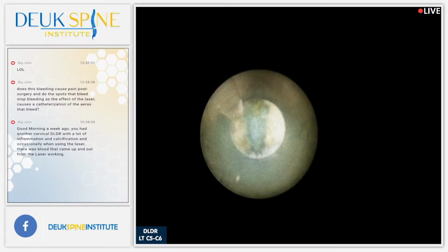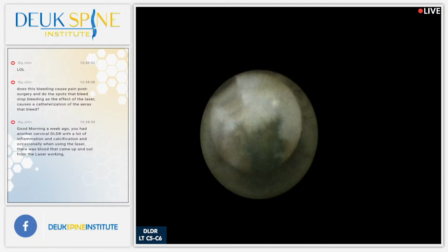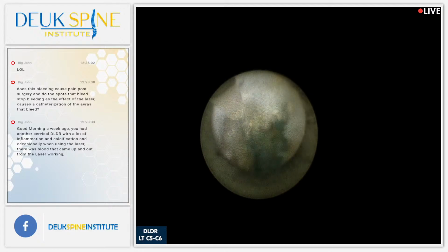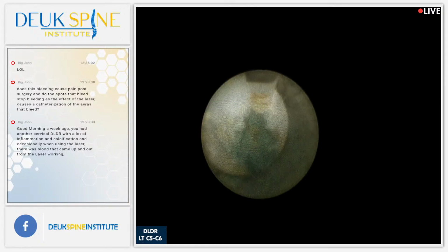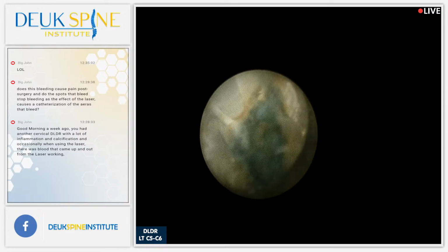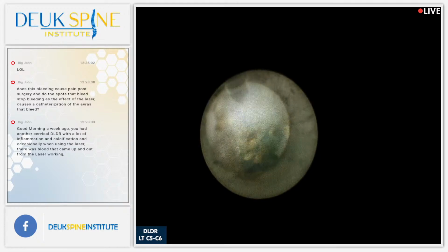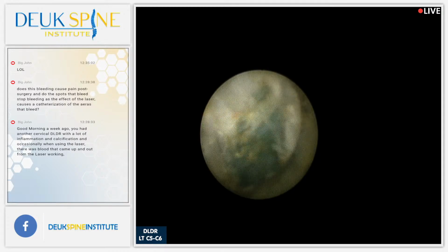By the way, this patient's disc right here, what you're seeing, is what we call relatively well preserved, meaning he doesn't have a degenerated disc too bad right now. It's very mild. And a lot of people wait on getting fixed. They wait too long. They wait for years, unfortunately. And if you wait that long, you're going to have more damage done to your disc.